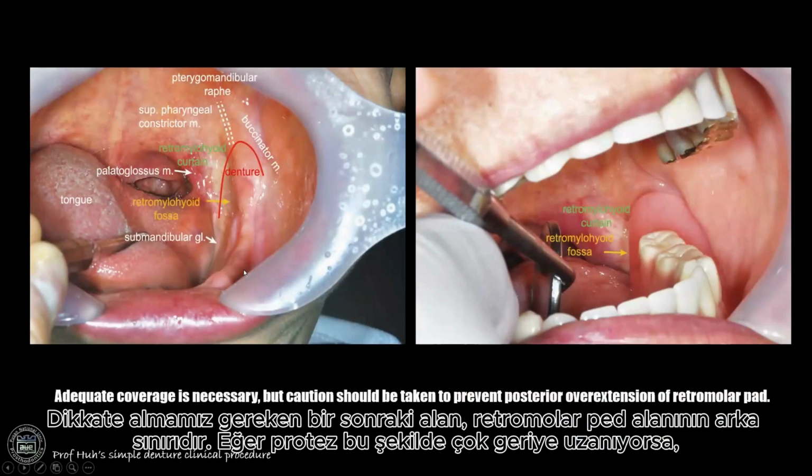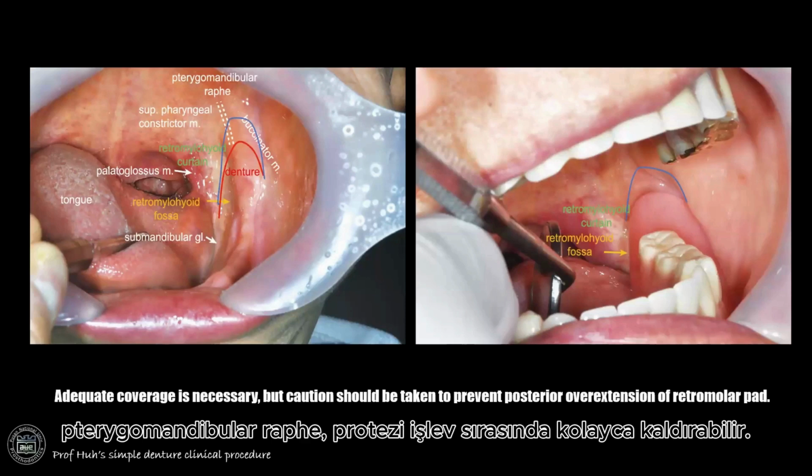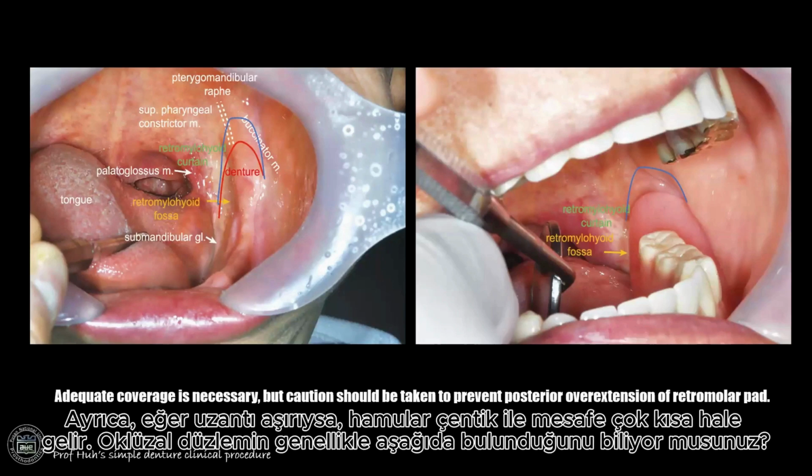The next area we need to consider is the posterior border of the retromolar pad area. If the denture extends too far posterior like this, the pterygomandibular raphe may easily lift the denture during function. In addition, if the extension is excessive, the distance to the hamular notch becomes too short.